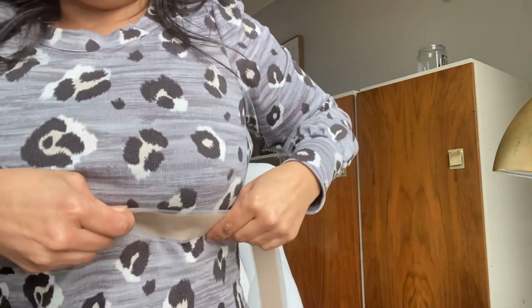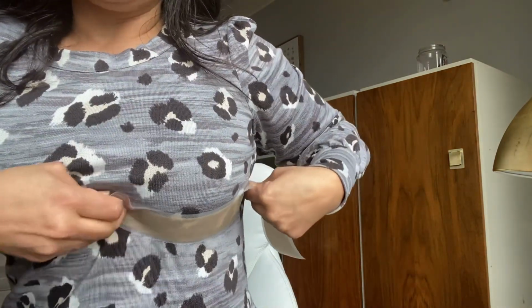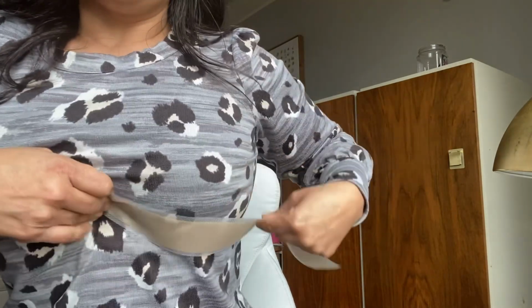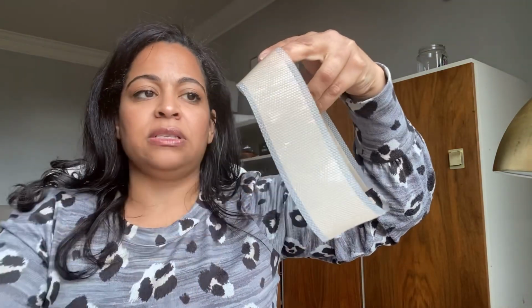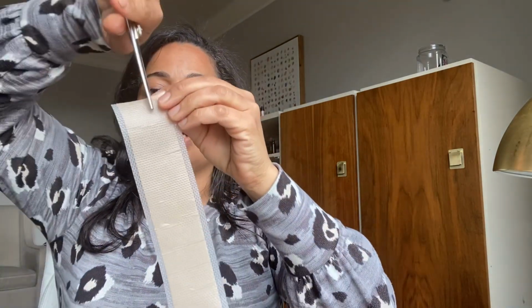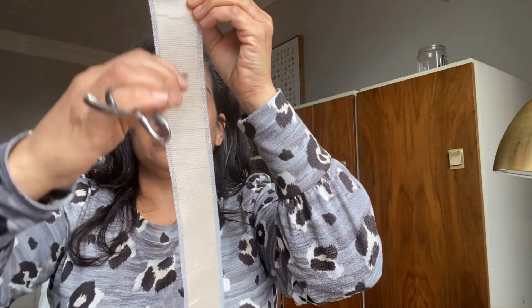The next cut I make is I go under this breast tissue here, under the crest, and I go from here to here. Guys, remember I have on this compression bra, so it's kind of hard for me to show you this, but you go from one end here to this end here. You want to go from the edge of your incision to the edge of the other incision, okay? However long that is, you're going to cut this here. And then you don't need this big wide strip to save money. You're going to cut it lengthwise. When you know how long that is and you've cut it here, you're going to cut it lengthwise here. You use 1 tape here, 1 tape here. You also will do the same here.